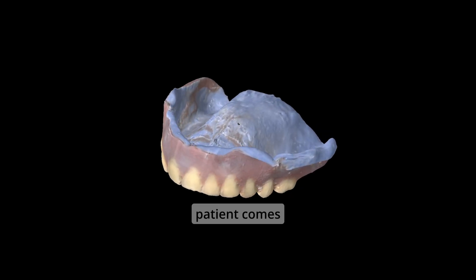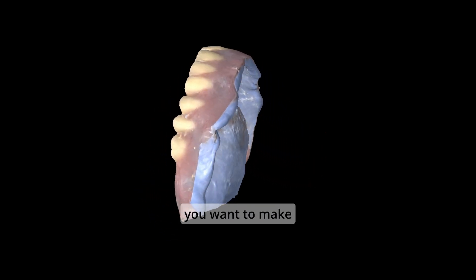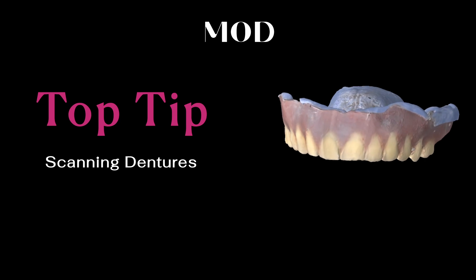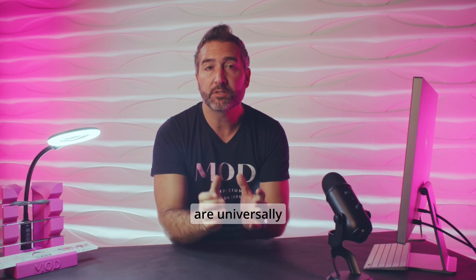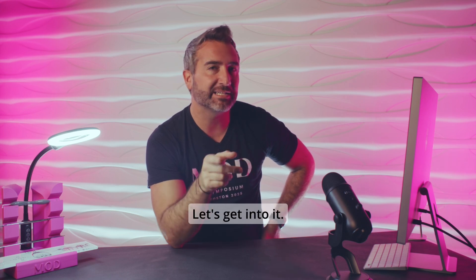Model Institute top tip: what is the proper way to scan when a patient comes into your office with an existing denture that's ill-fitting and you want to make a new denture for them? I'm going to take you through the steps I use on the 3Shape Trio system, but these are universally applicable to any scanner. We're also going to show you what these files look like in ExoCAD. Let's get into it.